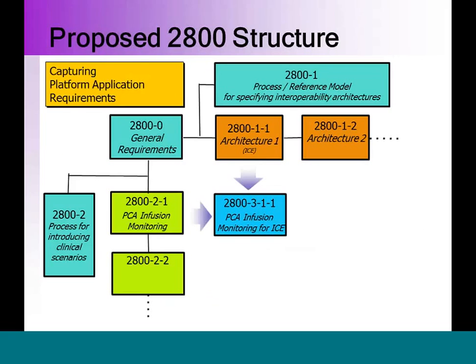And then finally what you can do is say, well, I want to use this platform here to implement a particular clinical scenario. So you get the context information regarding top-level hazards brought down to here, and then you reason in terms of your particular architecture safety features that are guaranteed here. There's a standard that would describe how those pieces are brought together.